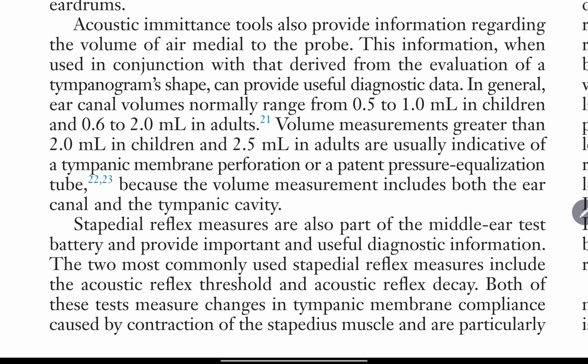Measurements greater than 2 ml in children and 2.5 ml in adults are usually indicative of tympanic membrane perforation or a patent pressure equalization tube, because the volume measurement includes both the ear canal and the tympanic cavity.